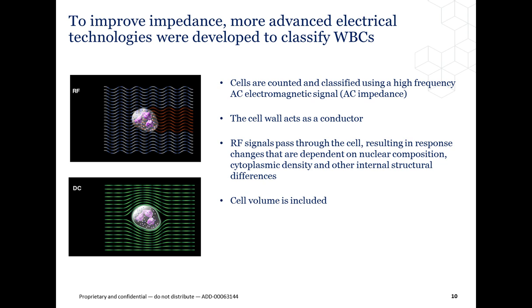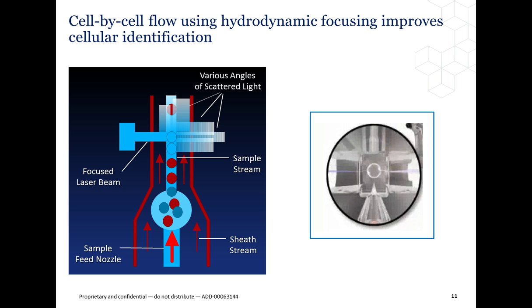So one of the difficulties associated with cell measurements, as we saw with the impedance transducer, is really controlling the WBCs and other cells from irregular recirculation in and around detection zones, in the case of the impedance, the aperture. This interference or duplication of signals by the same cell required correction, and it was found that for impedance this could be resolved by examining resulting pulses and applying pulse editing circuitry, to try to evolve past the problems that the cells created when they were detected more than once. However, for optical detection, a new approach needed to be developed.